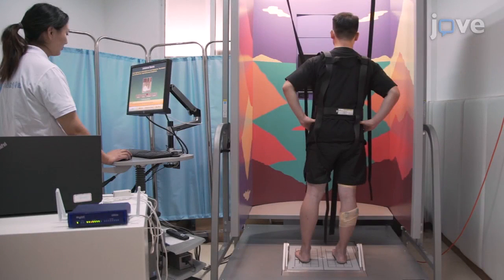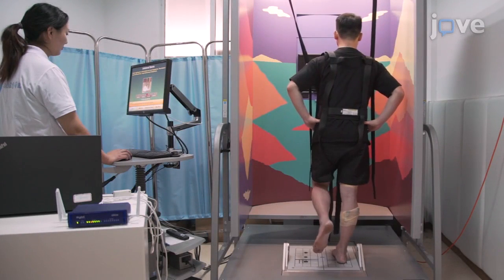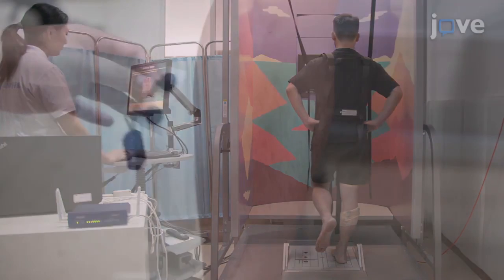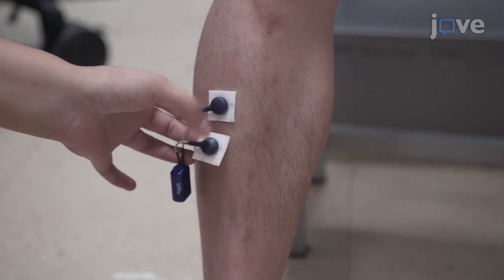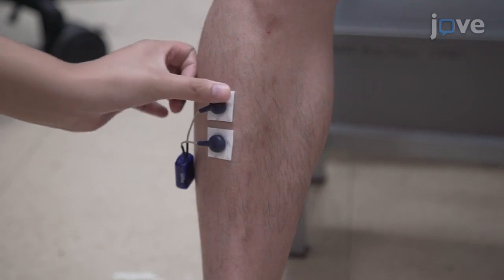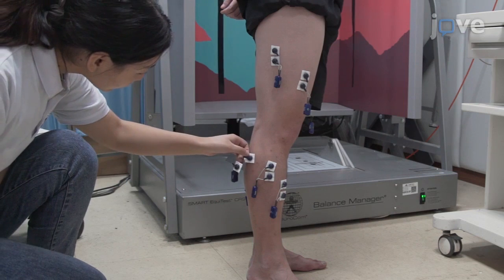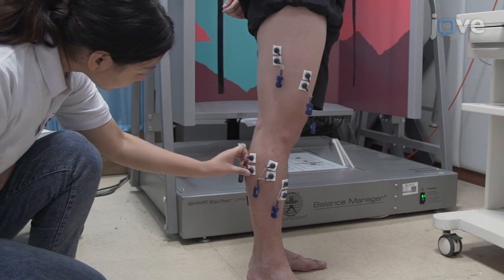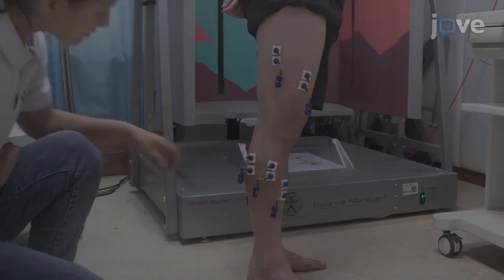This protocol presents a novel approach for evaluating the coordination of the visual, somatosensory, and vestibular systems and related muscle activation required to maintain postural stability. This technique can be used to perform a comprehensive investigation of the neuromuscular control for chronic ankle instability through the combination of computerized dynamic posturography and related muscle activity.